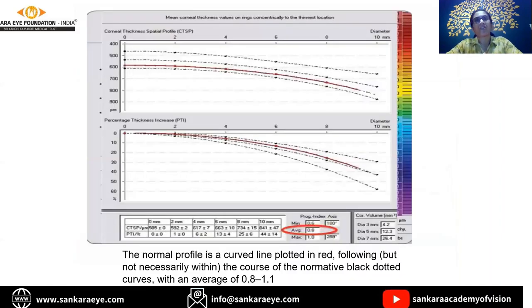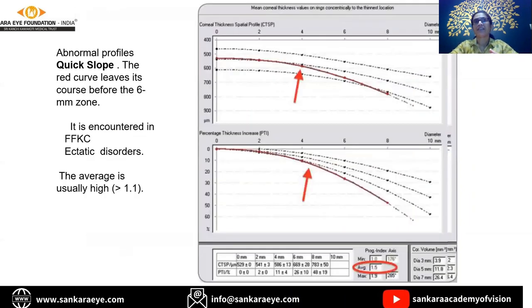The pachymetric thickness spatial profile is a plot of how the cornea progressively thins or thickens from the thinnest point outward. In a normal cornea, the red line runs between the black dotted lines with a slow, uniform transition. In pathological diseases with focal thinning, there is a quick slope. Classically, if the red curve moves away suddenly before the 6 millimeter mark, it indicates ectatic disease, seen in keratoconus or PMD patients. In PMD, you get a reverse pattern because the thinning is extremely peripheral.